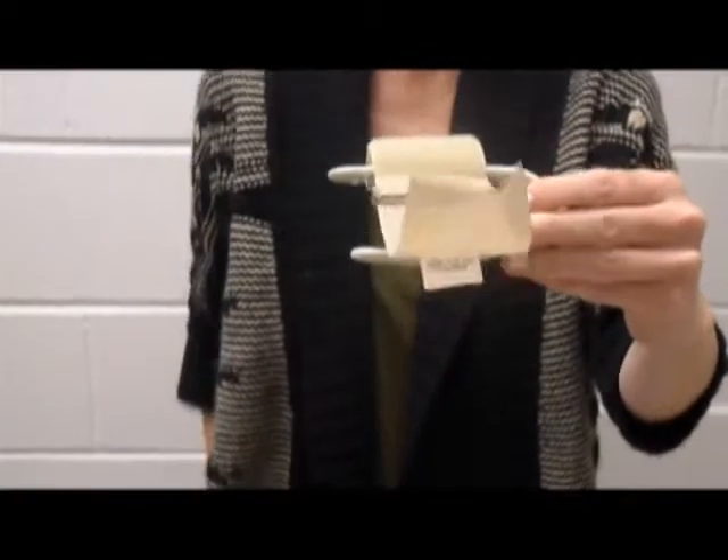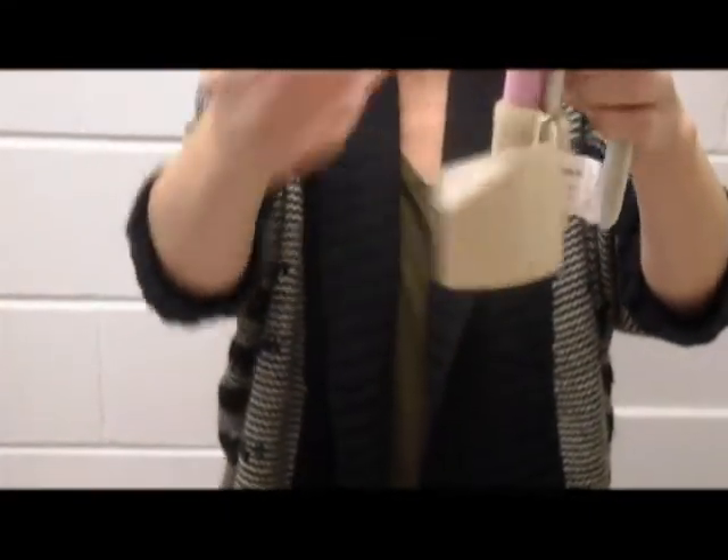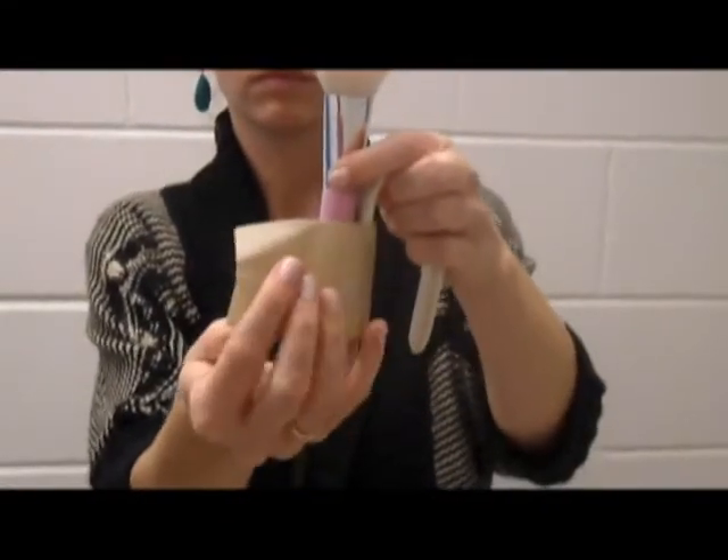The grooming tool is placed on top of the splinting material where the screws are, and the velcro is wrapped around to secure the tool in place.